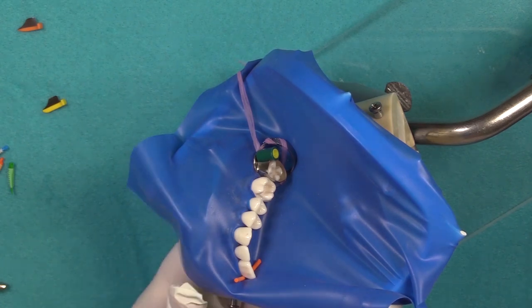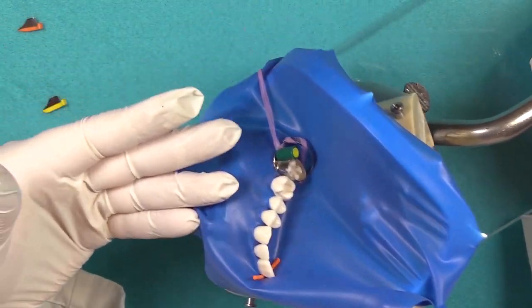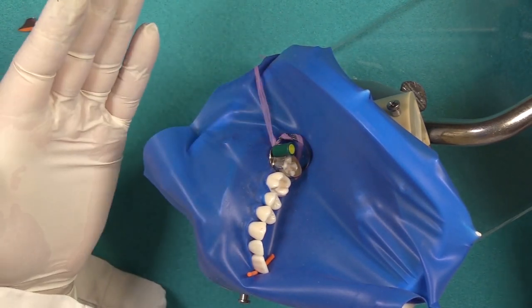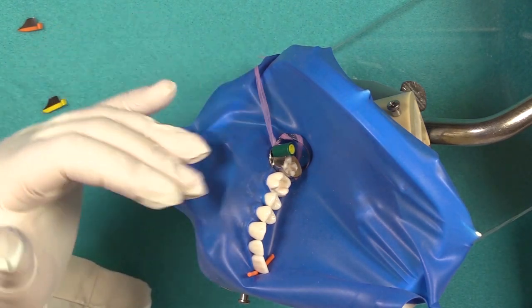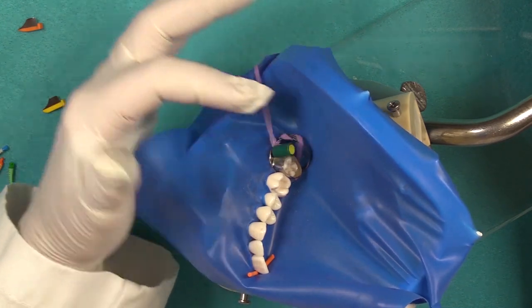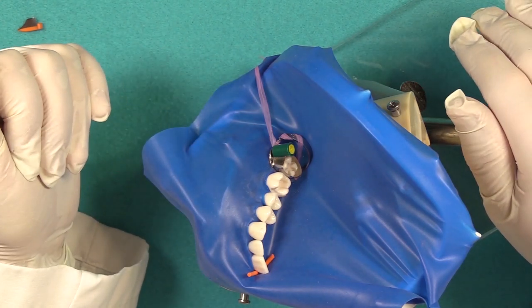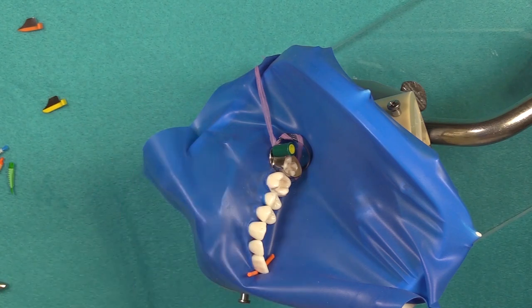The benefit of this real matrix is that I was able to keep the clamp in place along with the matrix system. But if for some reason you had to remove your clamp in order to do the restoration, you can still remove the clamp and the little matrix hub will keep the dam intact — it'll keep it so that it doesn't slip off the tooth. That's the benefit of using the real matrix system.